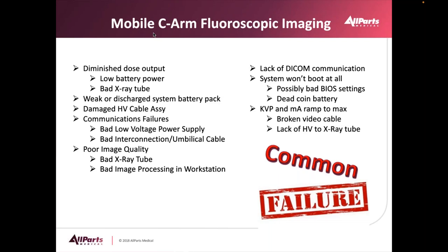We have poor image quality. We can have a bad x-ray tube, not enough power coming out. We have bad processing in a workstation. Our IIs could be weak. We have lack of DICOM communications, which usually is the motherboard within the workstation.